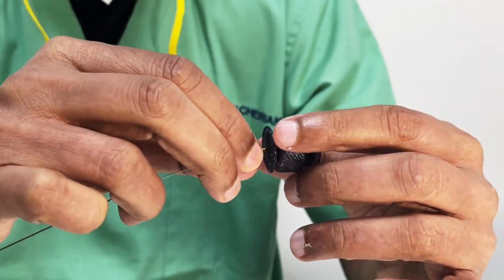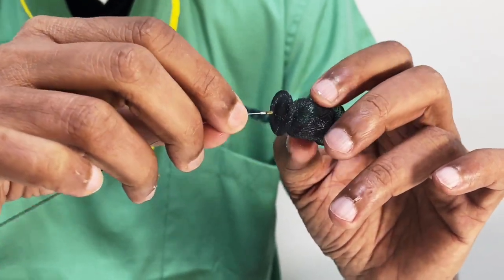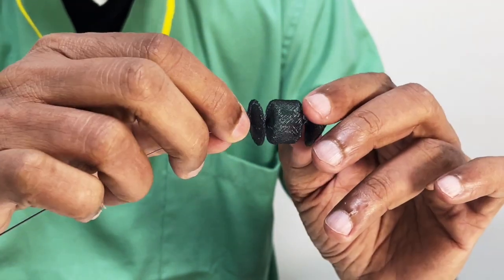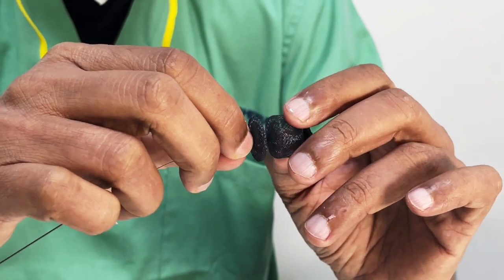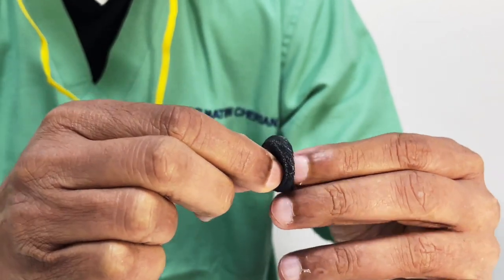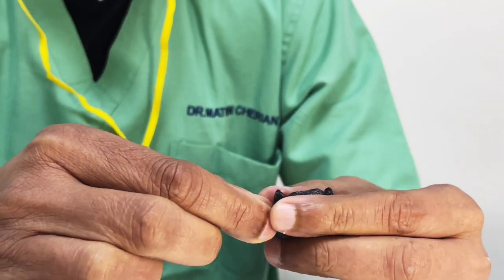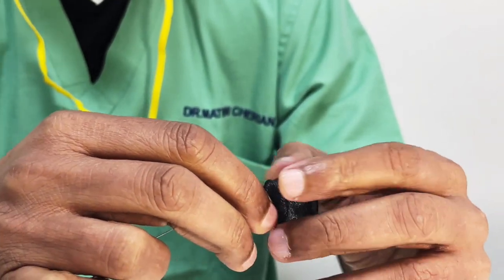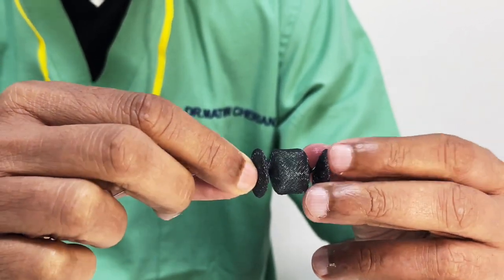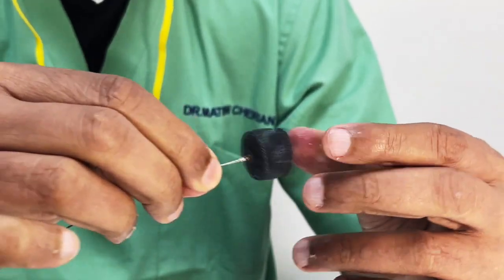It's a beautiful device, the Amplatzer plug. The best location for this is pulmonary AV fistulas because you do not want it to migrate onto the venous side, which can end up with a catastrophic consequence where it will go into the intracranial circulation and you can die, right? It's nitinol, so nothing can go wrong with this. You can pull it and push it several times in the body. The radiopaque marker is on the tip over here, and you may not see the rest of it properly, but it is a great device. Also, you can wait 10 or 15 minutes for it to thrombose, and then detach, though technically that's not necessary. Before you deploy it, make sure you do this pulling test to ensure that it doesn't move and it's very secure.